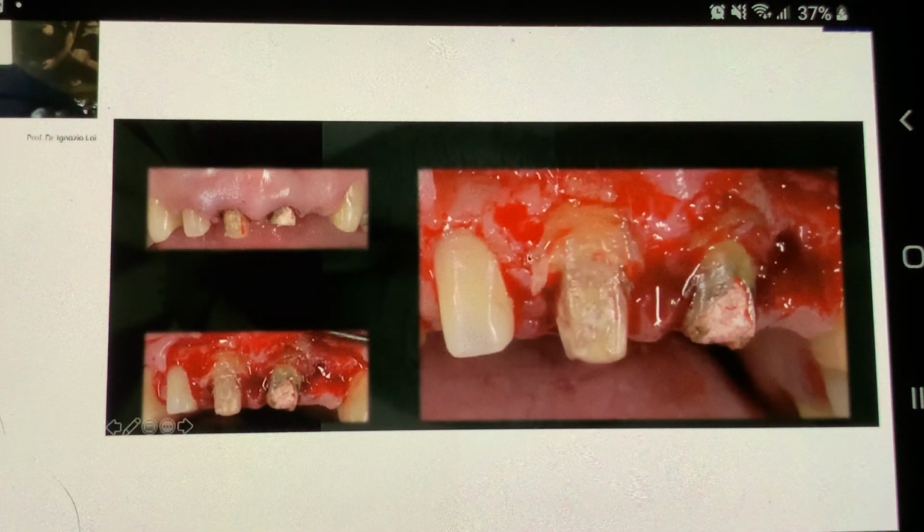Opening a flap, as you can see, I found a disaster in this preparation. We have chamfers which had been prepared. So you understand that to recreate chamfers, after preparing the teeth, we would already lose part of the teeth from an apical point of view. So we would have to create, through resective surgery, a preparation of the bone crest, which would displace by 3-4 millimeters from this.